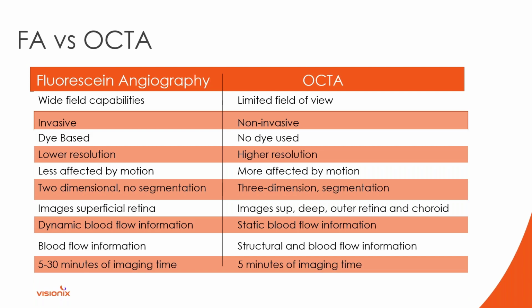OCTA allows for a three-dimensional segmentation that fluorescein really doesn't. In fact, with the advent of OCTA, we've learned more about what we call the deep retinal flow, or the deep retinal tissue, that we did not know about before in fluorescein angiography images. So that's actually very interesting.